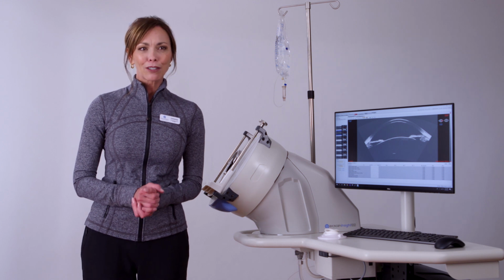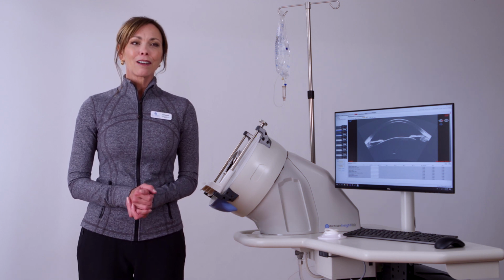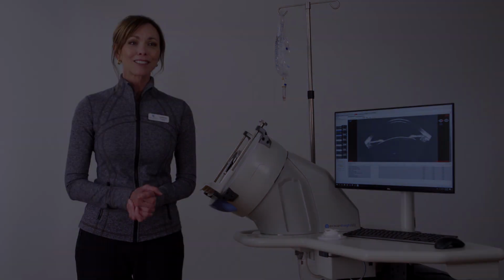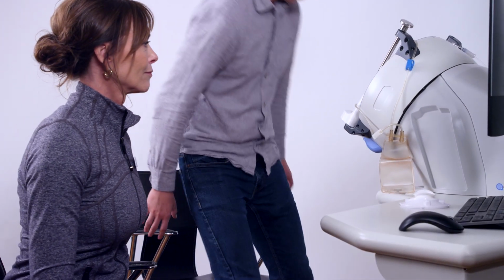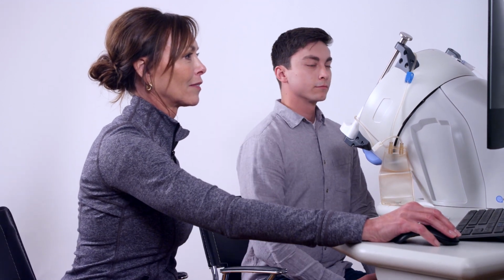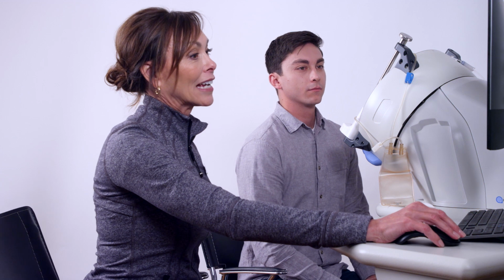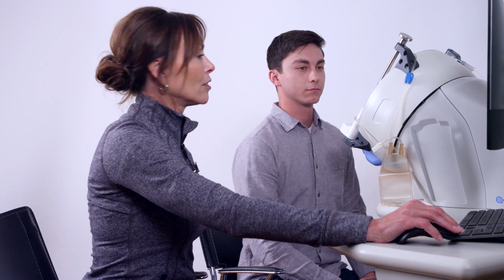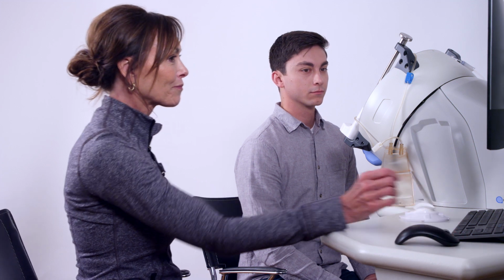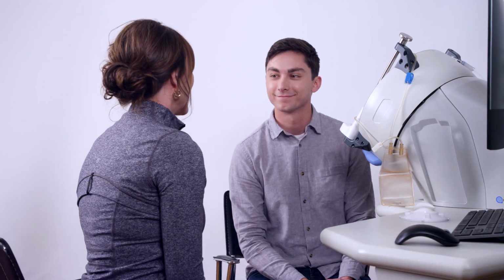When preparing the patient for what to expect during the exam, calm confidence is important. I often say something like this. This is a very advanced ultrasound that gives the doctor detailed images of the anatomy deep inside your eye. It doesn't hurt, it's just cool and wet because your eye will be resting in saline water. Because the water is cool, I will put a numbing drop in each eye to make it easier.